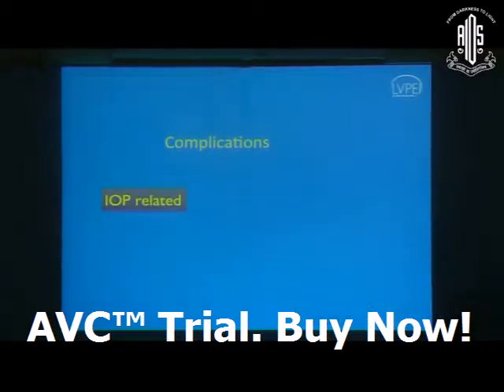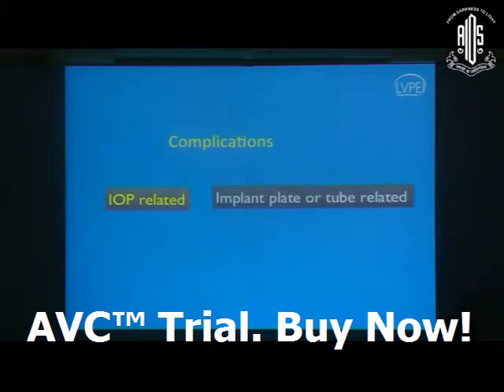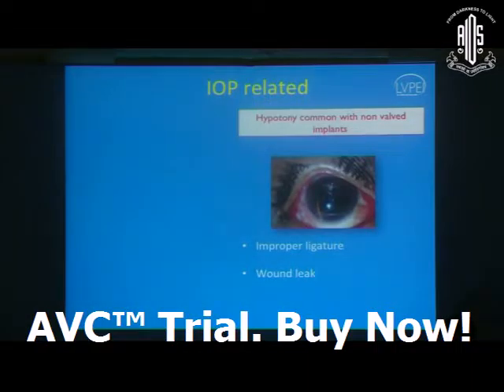When you're looking at complications, they can broadly be divided into two groups. One is intraocular pressure related, the second is implant plate or tube related. We do an implant procedure because we want to bring down the intraocular pressure, and conventional trabeculectomies are not helping. As in trabeculectomy, we also have problems of too low a pressure or too high a pressure.